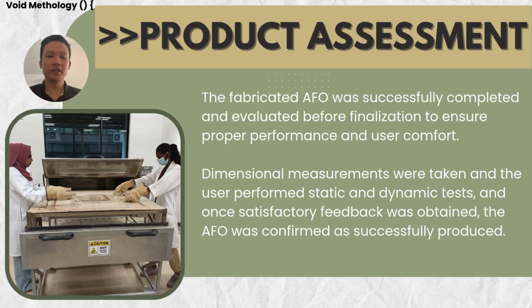Before we give the AFO to the user, we need to do the product assessment. So how do we do it? The product assessment was carried out to evaluate the performance and the comfort. The dimensions of the AFO were measured again and compared with the user's leg to make sure that the compatibility is high.